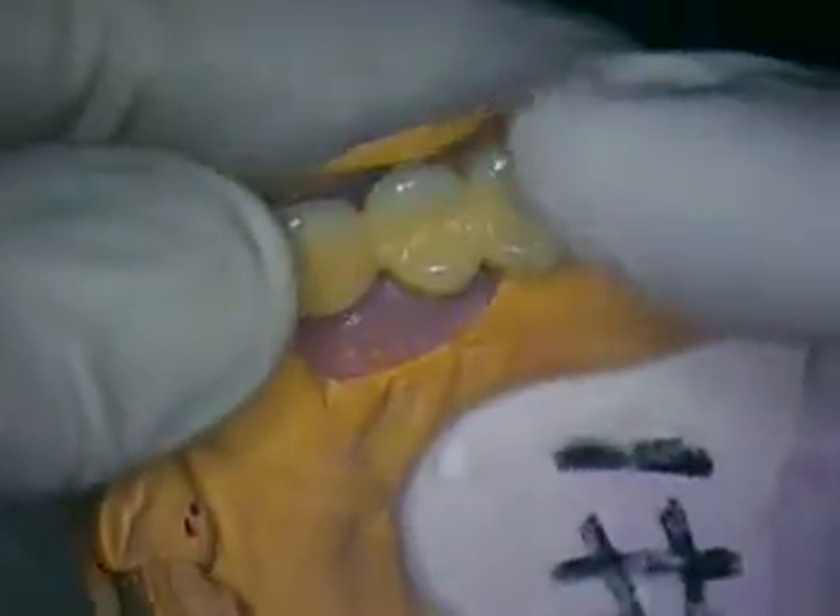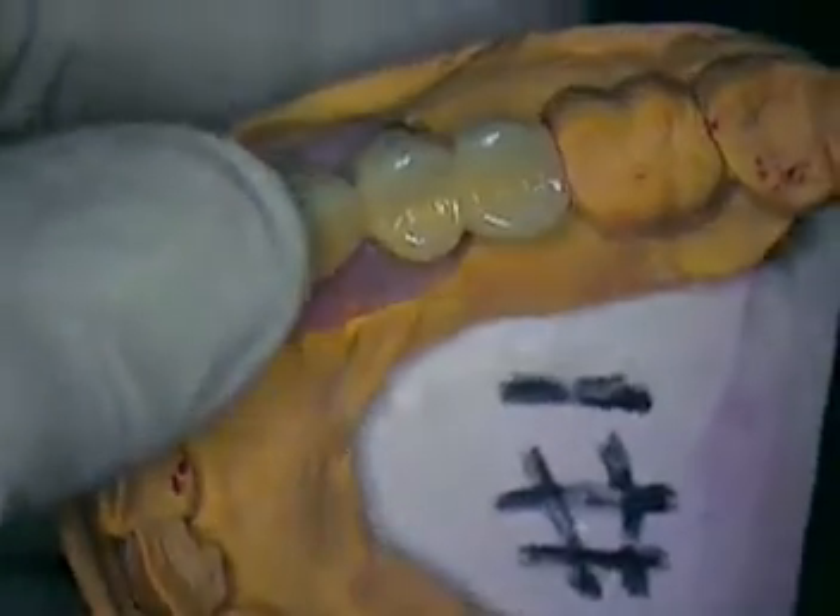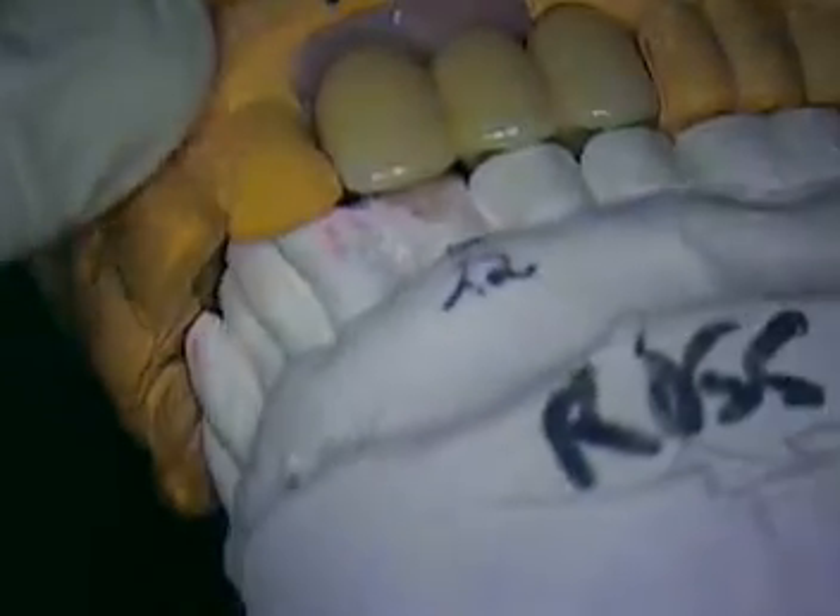So with that being said, I'm going to go ahead and pick up this filming where we are tightening the abutments down underneath the bridge in the mouth and ready to try in the superstructure. That's a little bit about this and we're going to pick it up with the next clip.